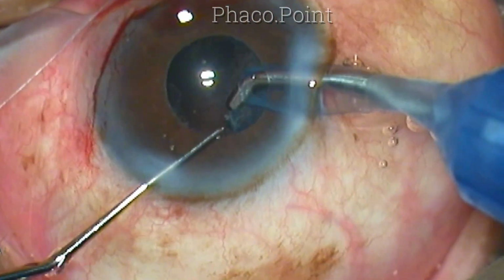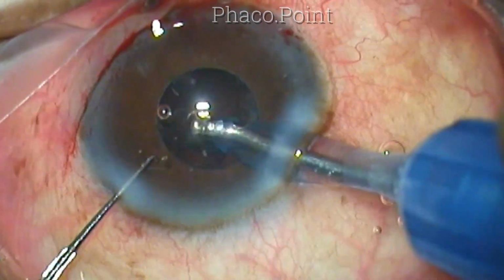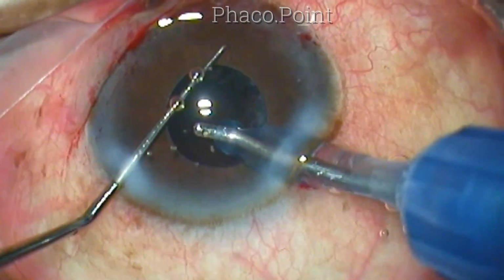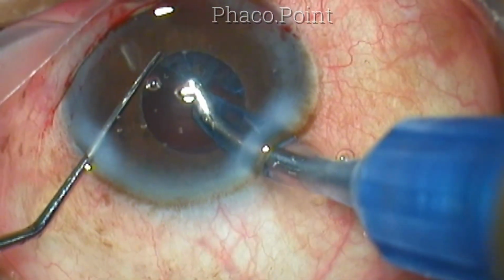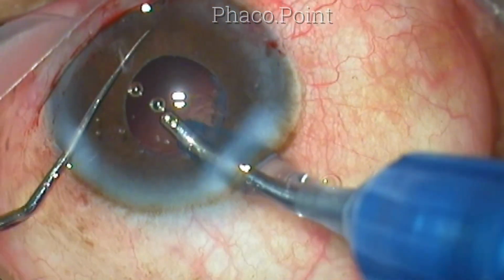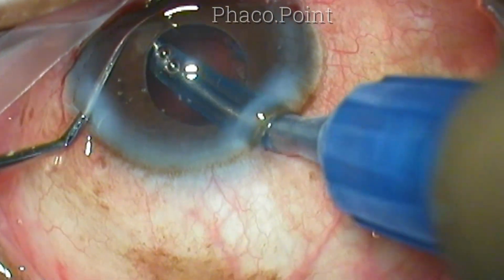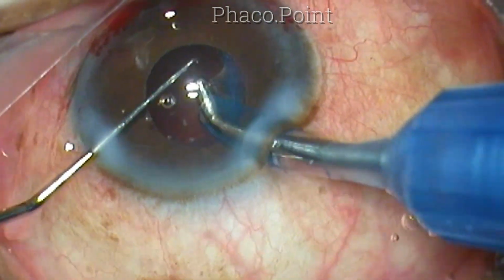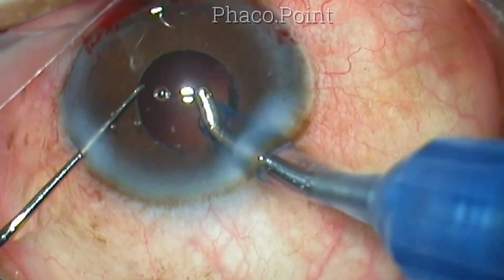Now this is where I have to reiterate that a good cortical cleavage hydrodissection will go a long way in enabling you to achieve easy mobilization of the cortex. Note at this point, when I am trying to tug at the cortex, something abnormal happens. I think I got hold of the anterior capsule at this point. Oh, yes, because you see the way it springs back in an elastic way. This will not happen if you are holding on to cortex.